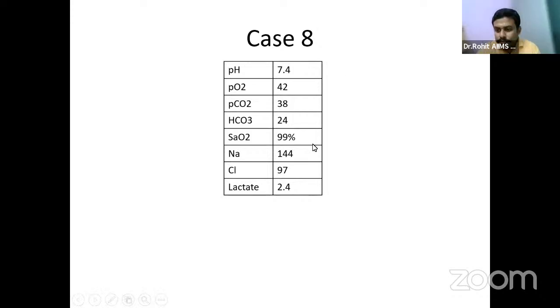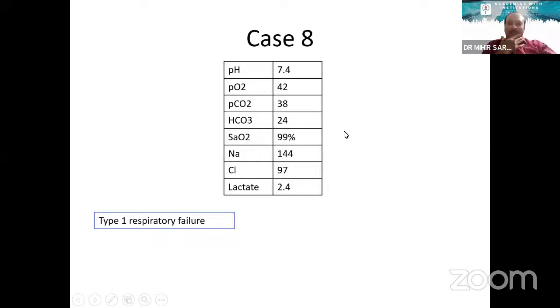Yes, sir. They are typing, sir. So the problem here is very low PO2 and normal SaO2, okay, and the rest of the parameters are more or less okay. So why is there a high difference between... Leukocytes can affect blood gas, sir. Yes, they are answering.